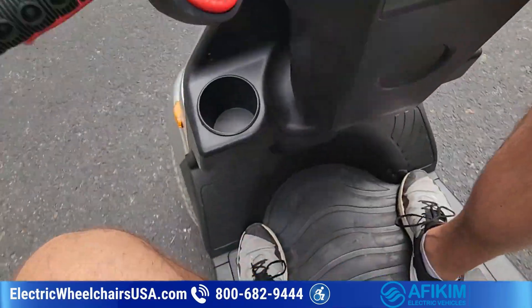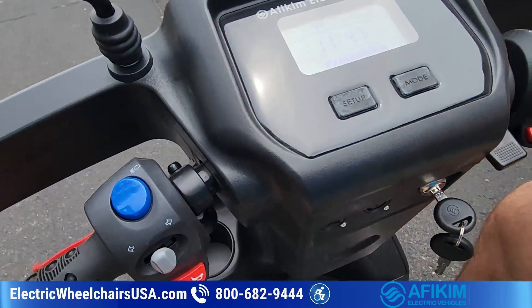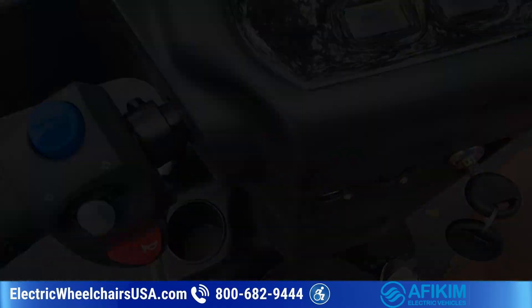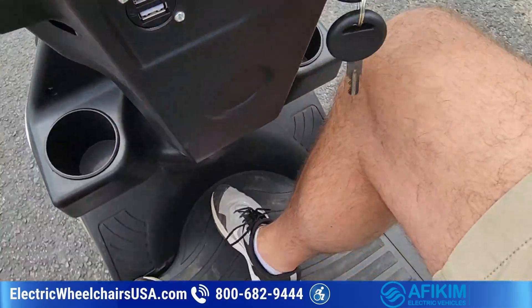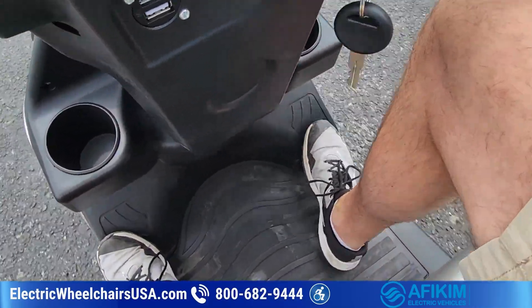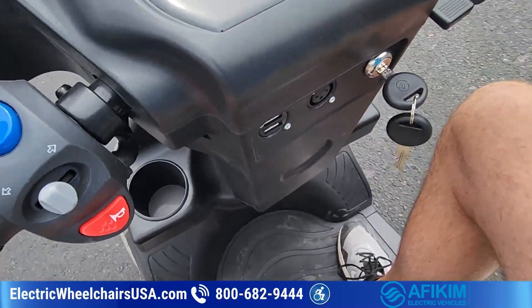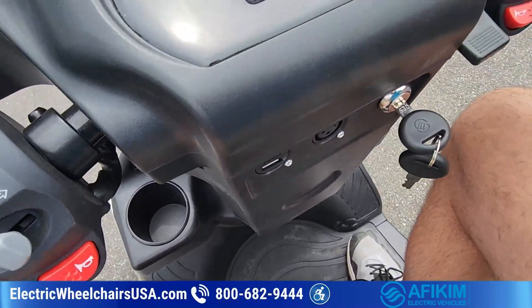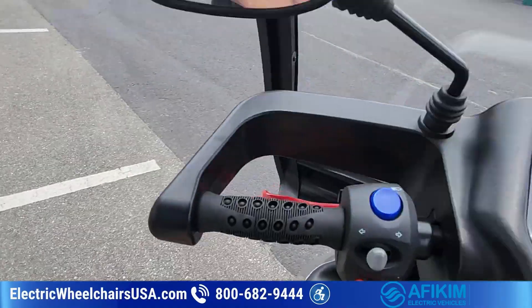I feel like the leg room is fine on the S4, but on the three-wheel S3 you actually have more leg room. Because of the way the floorboard is designed with the single front wheel in the center, you can extend your legs out a little further. That could be a deciding factor for you. Let me get off and get on the three-wheel and show you.